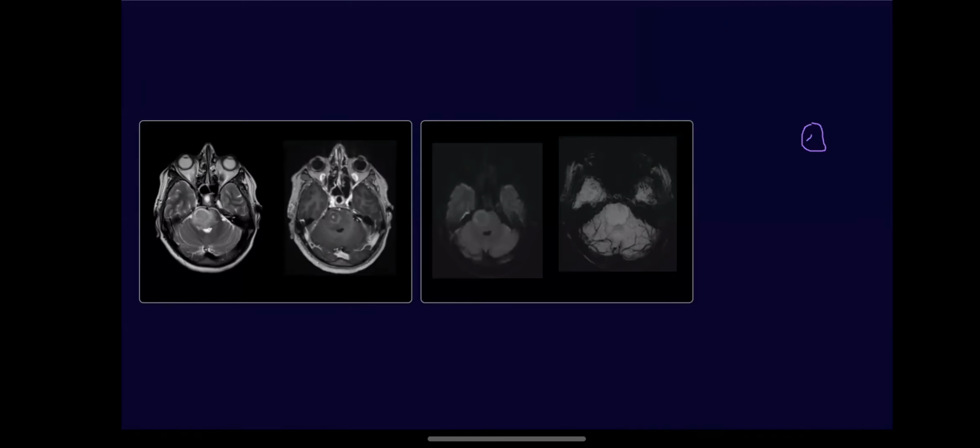So now this case was that of a 20-year-old female who presented to us with dubious symptoms. She was relatively doing well. She just had headache for the past couple of months, and we got the MR, and we were very surprised that we saw this lesion sitting in the pons. And we saw this T2 hypointense lesion sitting here. There's some amount of vasogenic edema. Of course, this is concordant with the size of the lesion.